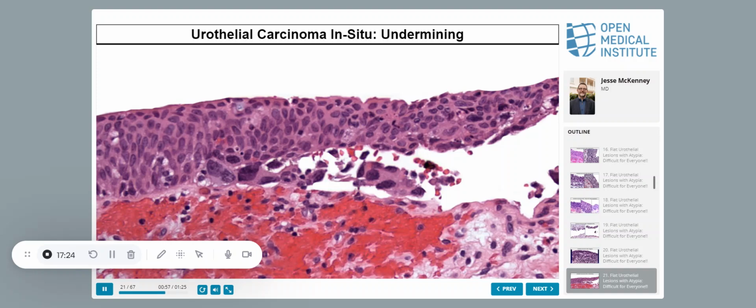Okay. Can you show the previous slide? Sure. I want to ask, is it the intact umbrella cells on the top? There probably is. They're hard to see. So umbrella cells are easier to recognize when they're big and atypical, and they're vacuolated. But there probably is, but it's hard to see. I'll show you some cases where the umbrella cells are really prominent.